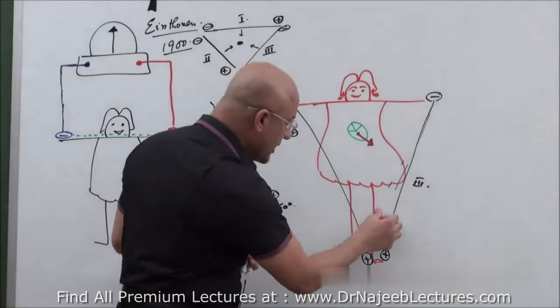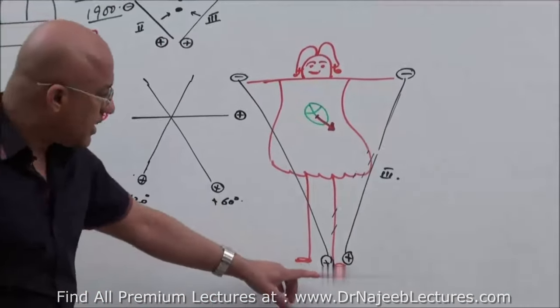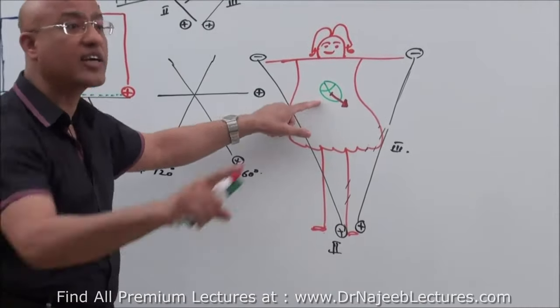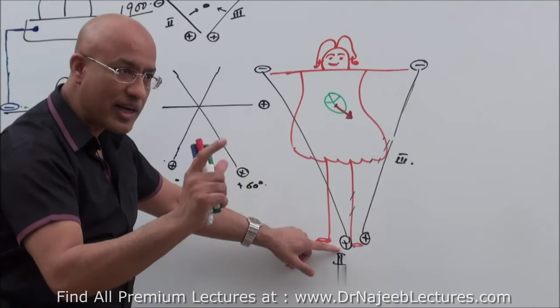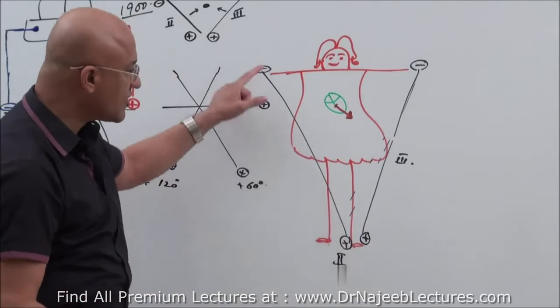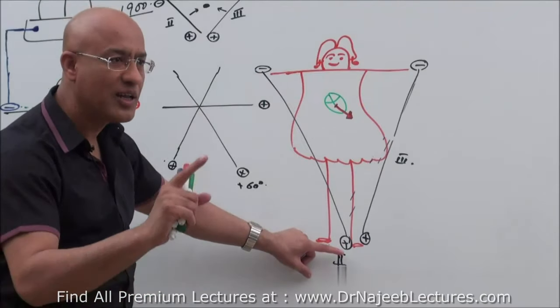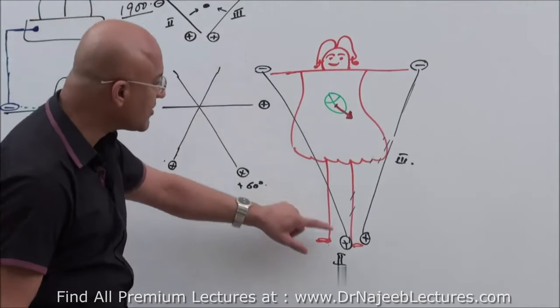Now, look at it, that lead number 2. Electrode of lead number 2 is trying to look at the electrical activity of the heart, but what is its axis? It is looking upward and rightward. Lead number 2, the boy number 2, okay, call it boy number 2. It is looking upward and rightward. Of course, it gets a glimpse from here.